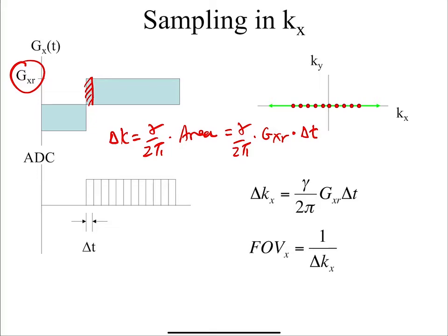All right. So the most important part of this is always this area. Okay. So no matter what pulse sequence you're doing, that's going to be correct. The formula for the area may differ depending on what pulse sequence you're doing.